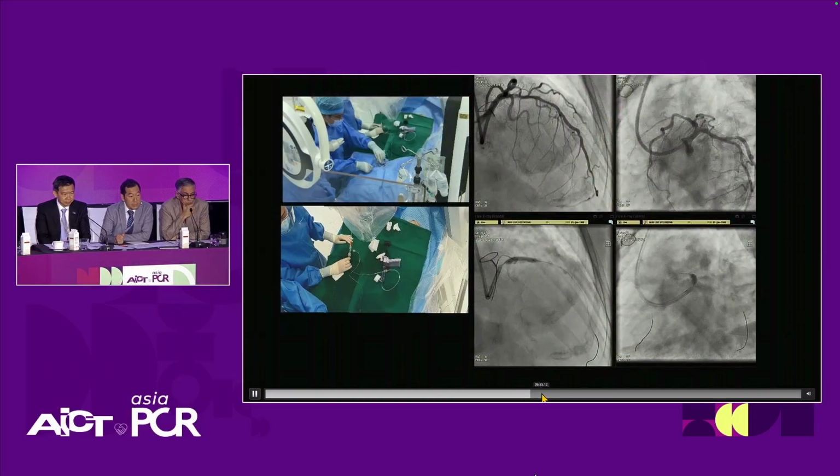And so I think that my own practice is to slightly undersize the cutting balloon and then do multiple cuts. So death by 1,000 cuts kind of thing, the Japanese traditional model. I think that works very well for me, rather than just one or two inflations at high pressure. Okay. Mark, you got the.